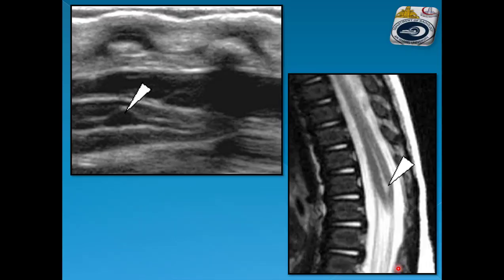By longitudinal ultrasound: mild dilatation of the terminal part of the central canal of the spinal cord. By T2 MRI: size less than 5 millimeters and stability over time confirm this as a normal variant.